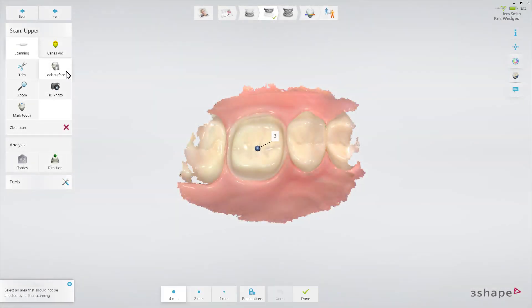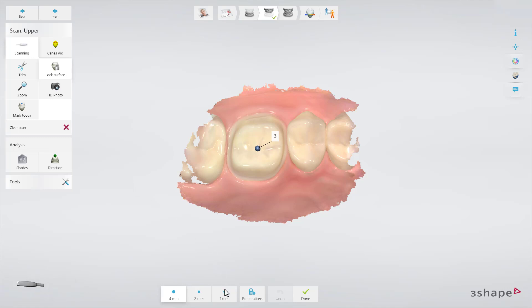The lock feature gives an option to freeze the surface in a given state. This feature gives you a toolbar where you can select a brush size and simply lock an area by painting it directly on the model. This prevents the scanner from adding gingiva that collapses on top of it.